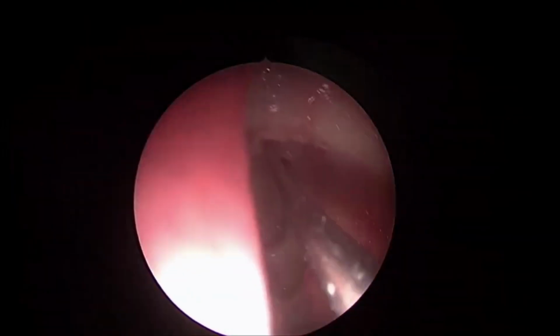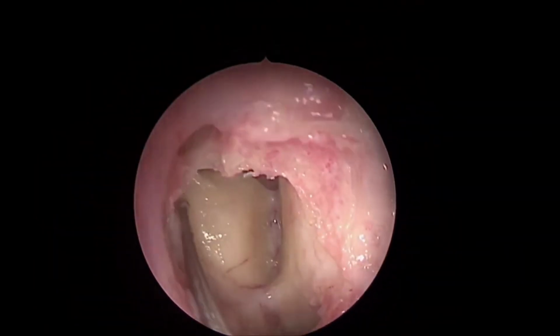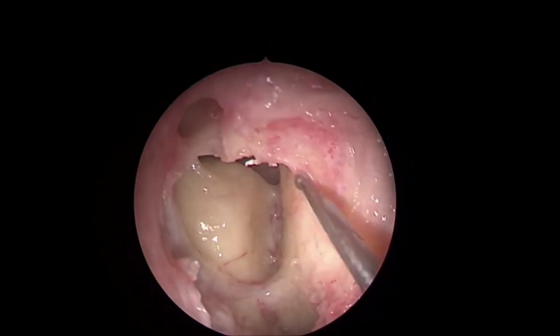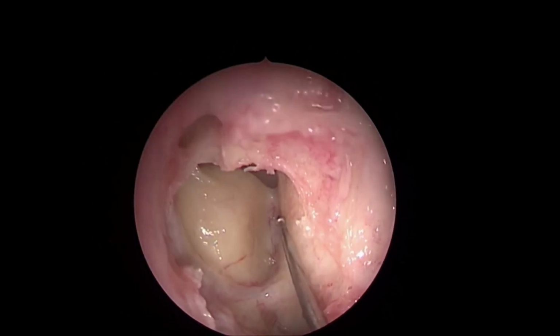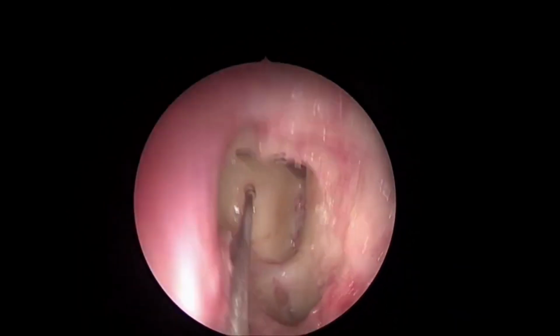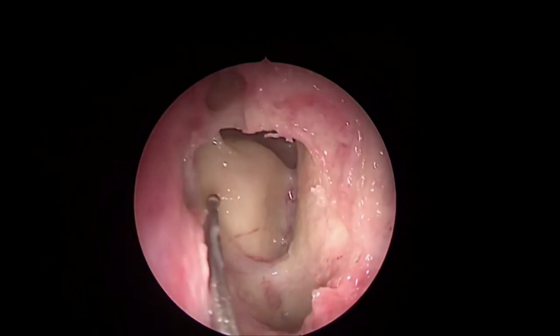do a complete job. Complete job means flush the frontal sinus to the limits. So like, I flush this to the lateral limit. See this? No septa is overhanging. Overhanging septa may bridge the mucosa and can lead to stenosis.